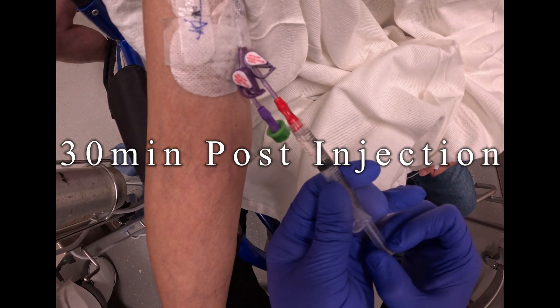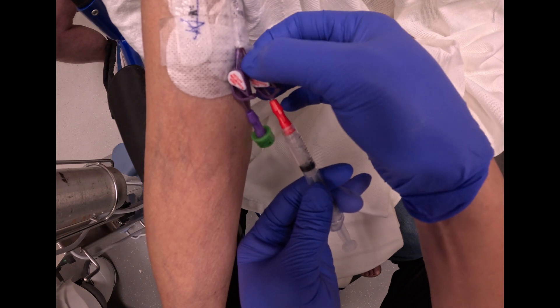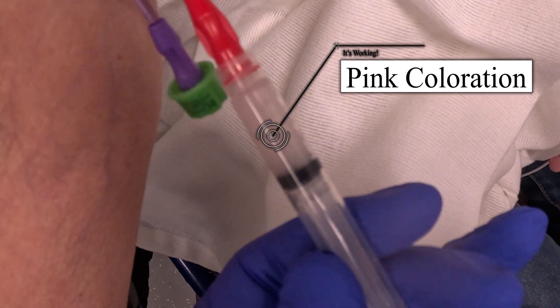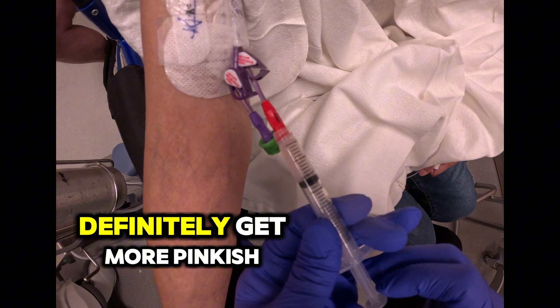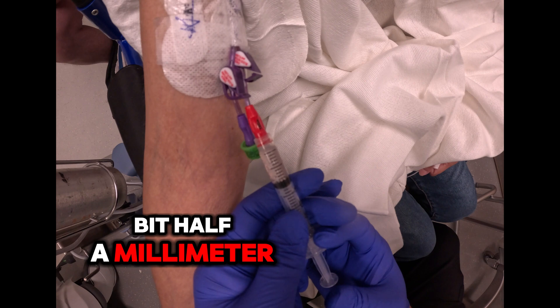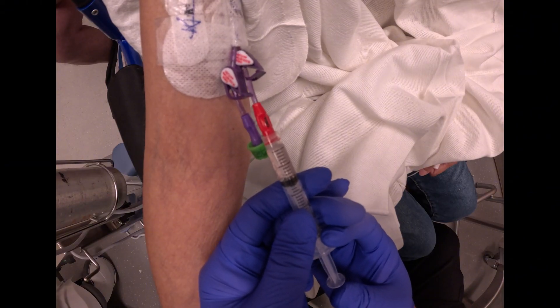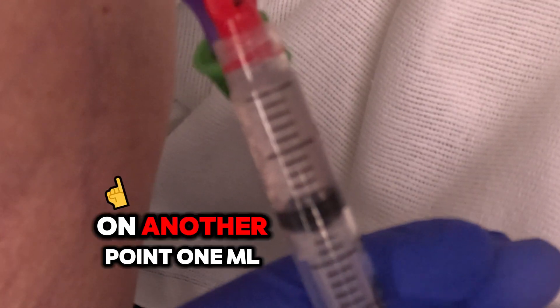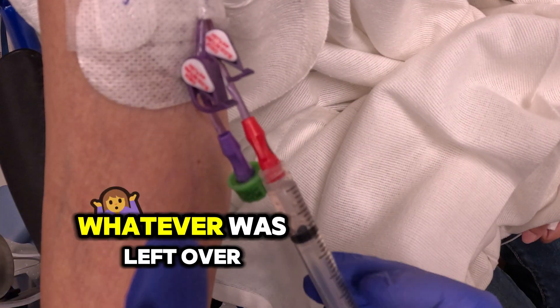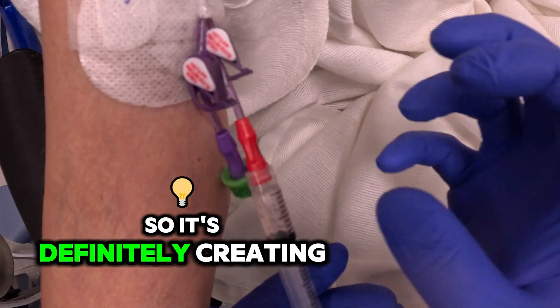So this is the 15-minute check. Not much has happened, so we're going to keep on keeping on. Definitely getting more pinkish. At 1.1, it went in a little bit — half a millimeter. Look at that — half a milliliter. Let's see if it'll go in another 0.1 ml. So what I did was push in whatever was left over of that cath flow, and now I've put in some fresh cath flow. It's not leaking anywhere, so it's definitely creating an opening at that site. We're going to wait another 15 minutes.